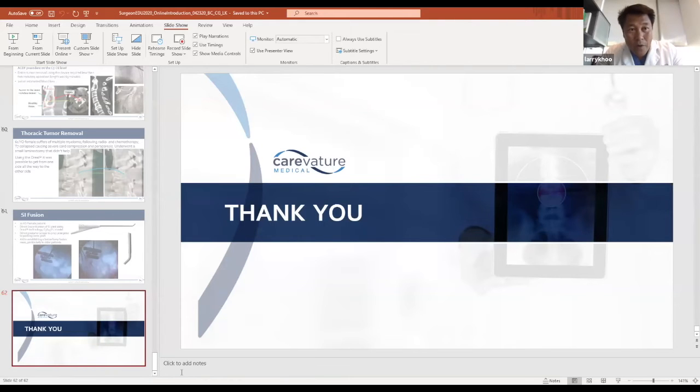Honest answer, Steve. When I first started, I sucked at that. You're good with the straight drill and the Kerrisons for certain things, and then you're working and you realize, hey, I'm coming at this particular lumbar space at a certain angle, and I'm having a problem going up and to the left, right? Like in a frame, depending on what side you're coming from. And sometimes you realize that I need the side cutting one or I need the up cutting one. So when we first started, there were cases where I used two or three different pieces in the same case, which obviously from a cost perspective can upset your OR managers.